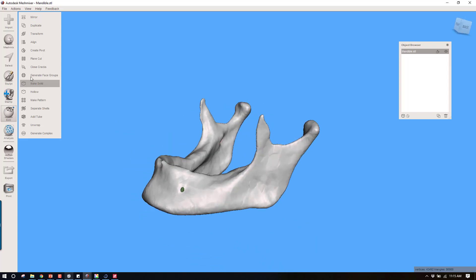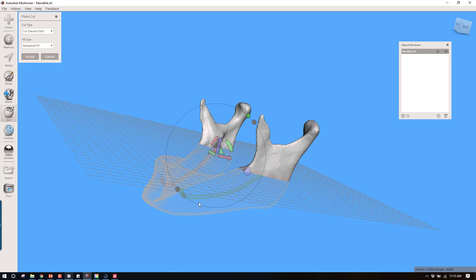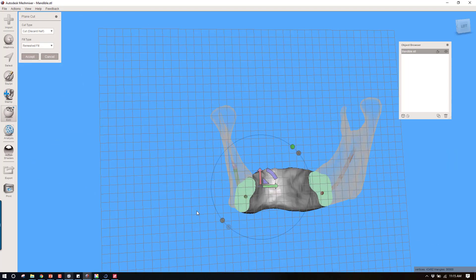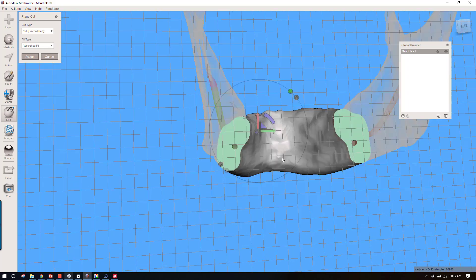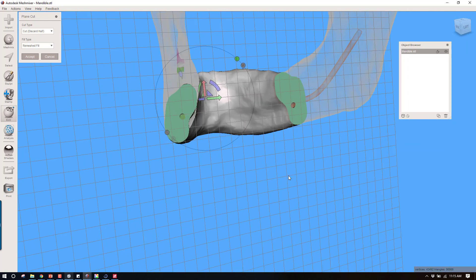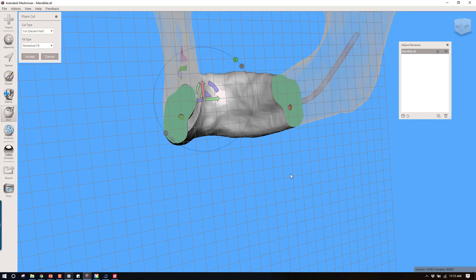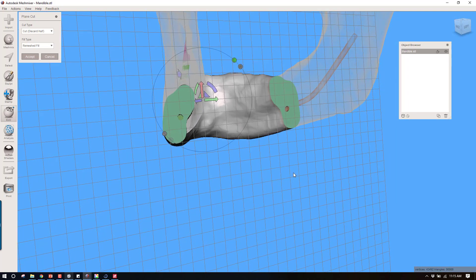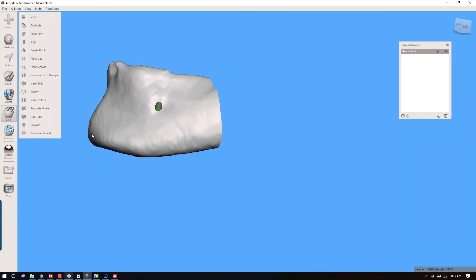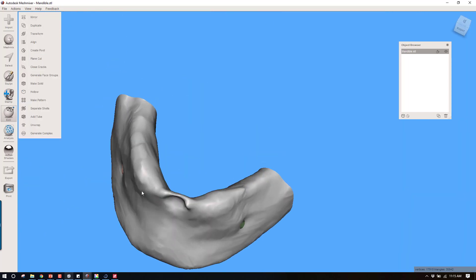If you were to look at this in a cross section, you would be able to see that we've got that nerve tube now basically running throughout the mandible. It's in the correct anatomic position. There's a lot of ways that I use this function for Boolean subtractions.